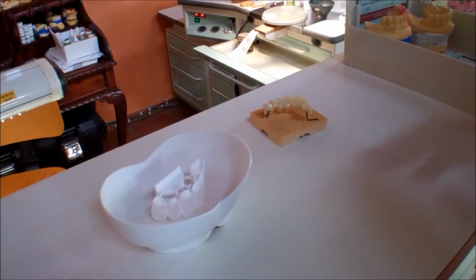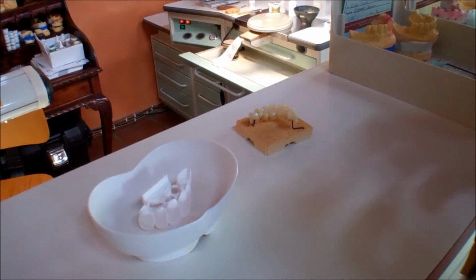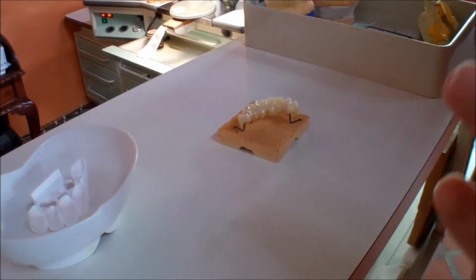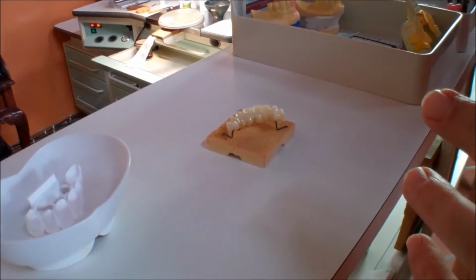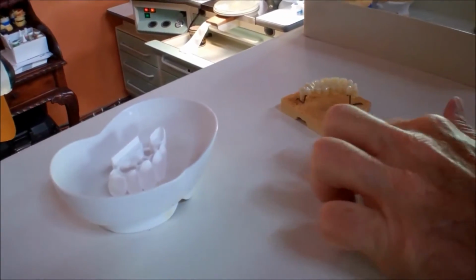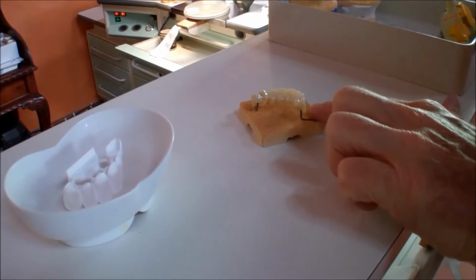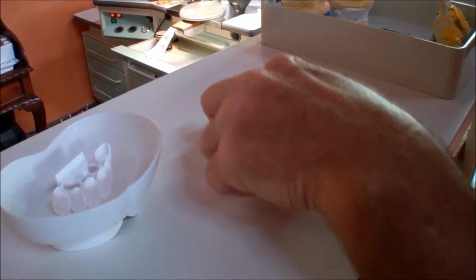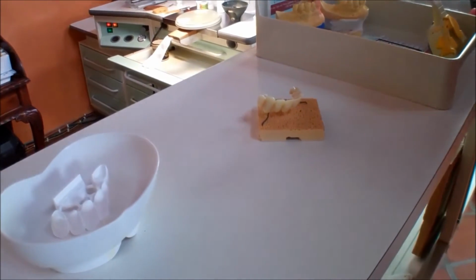It's some liquid that you put in, and you start to drink this liquid because it goes inside. Then I put it in the oven for 8 hours at 1,600 degrees. That's very high. And so you see the difference of the size. And it comes out ready. So you have all the function of the canine to premolar in zirconium, and we're going to build it up with porcelain in the vestibular. Very nice.